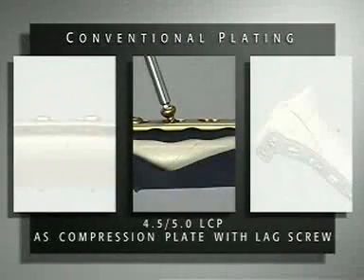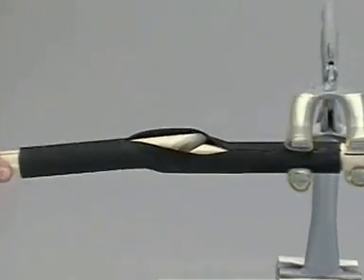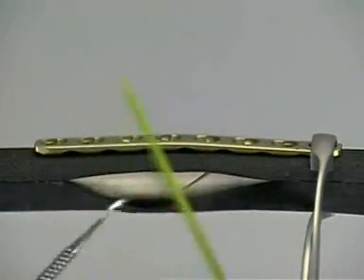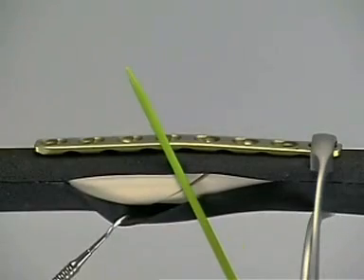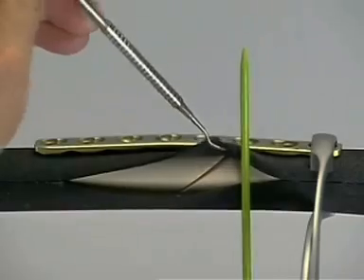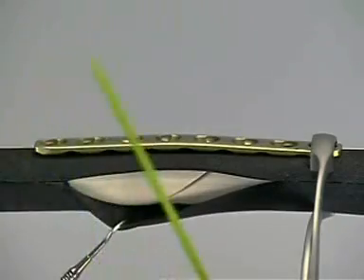In this exercise, the function of a compression plate in combination with a lag screw will be shown. A new bone with a simple oblique type A2 fracture and a black foam sheath to simulate the periosteum will be employed. The same eight-hole LCP is used. The plate is fixed on the bone with the bone-holding forceps. The position of the plate is defined by the planned direction of the lag screw. Compression of the fracture will be obtained in the axial direction by two eccentric screws and one interfragmentary lag screw.